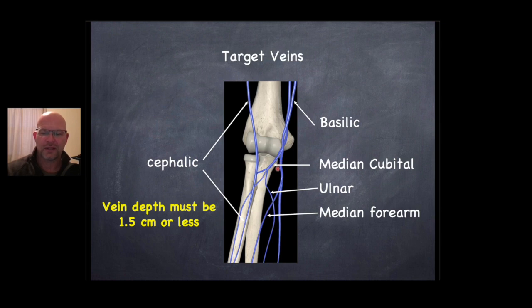And this is just kind of the anatomy of that area. What you're looking for is 1.5 centimeters deep or less is the goal. But a lot of these get stable and about 1 centimeter deep running right through this area. You'll have a lot of twists and turns up here, bifurcations. I'll show you some of those. And these can come together, they can separate out again, kind of a reverse bifurcation, a fork in the road. So you'll see a lot to navigate up there in the AC area.